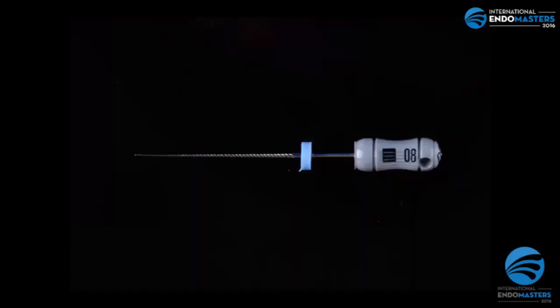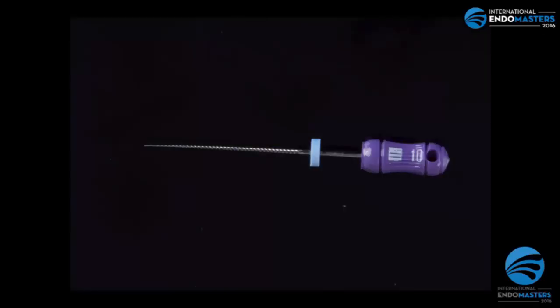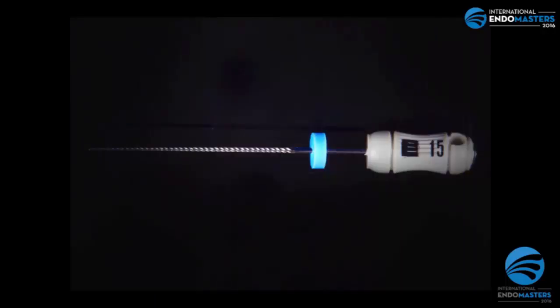We are going to start using the K file number 08 until it reaches the working length. Then we irrigate to flush the debris from the canal. Next, we use the number 10 K file again until we reach the working length. Finally, we are going to use a number 15 K file.